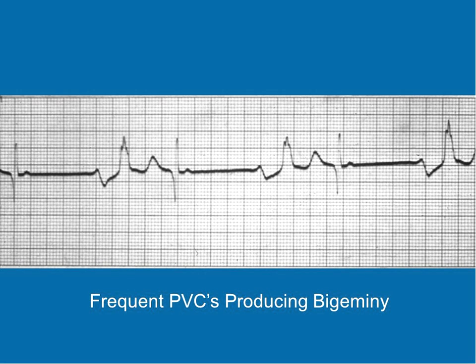This is bigeminy. It's every other beat. So here's your normal beat. No, sorry, that's my PVC. The normal beat looks pretty sick, actually. So here's the normal beat.